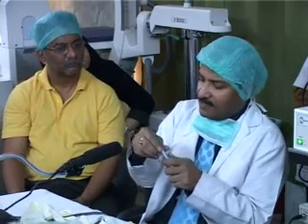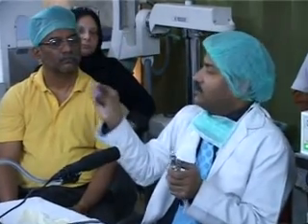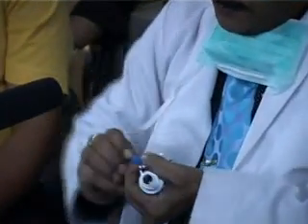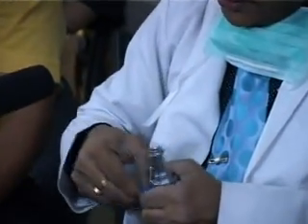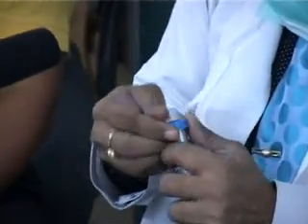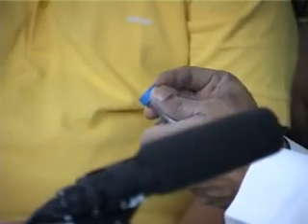Third place is this rubber itself, and if it is torn, like I will just show you, sometimes with repeated use it gets torn. I am just tearing it. Now it is torn. Can you see? Yeah, it is torn. It must be replaced. Just like it is not visible, but now it will leak from here, isn't it?